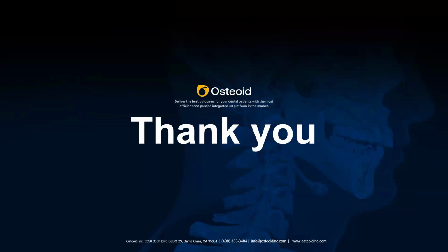Okay. Thank you for that. Another question is, do you have a recommendation for the best CBCT machine for endodontics? Yes, we have a number of cone beam CT units at the School of Dentistry. Obviously, we don't have all 64, or now I think 75, different varieties. We have a lot of experience with the Carestream, with Morita, with Acteon, and all of those units have capability of looking at images and producing small field of view with high resolution, adequate for the purpose of endodontics. I think any of the units at all now are like that.